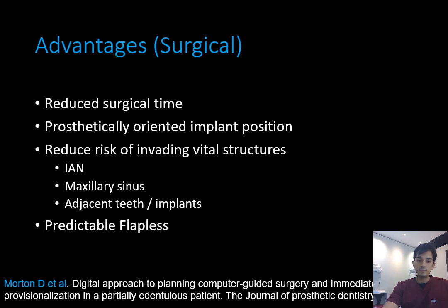So having the benefit of intraoral scan, digital planning, guided surgery has several advantages from a surgical standpoint. Dean Morton, in his study, pointed out, firstly, the reduced surgical time. That's probably the biggest factor in why I use surgical guides.